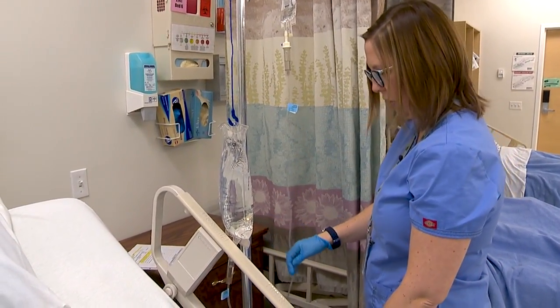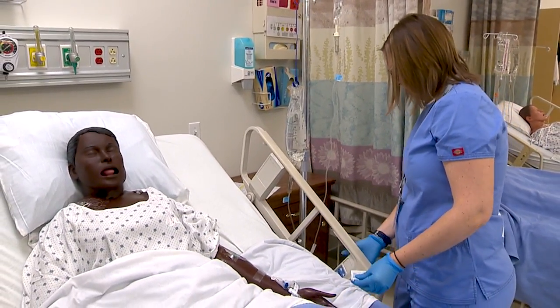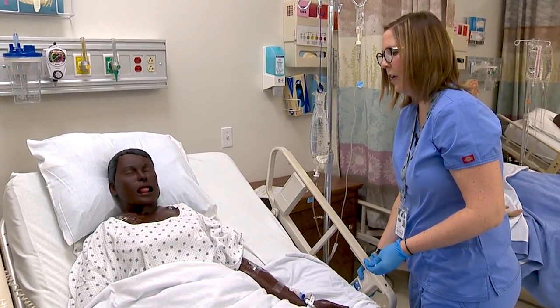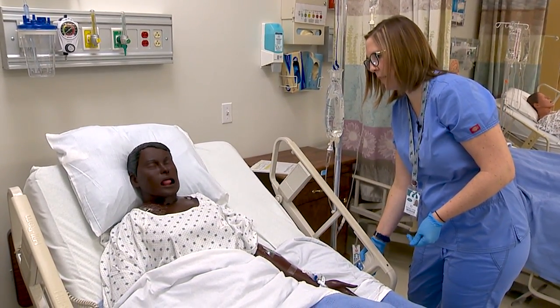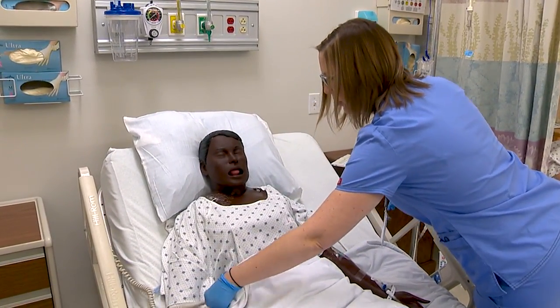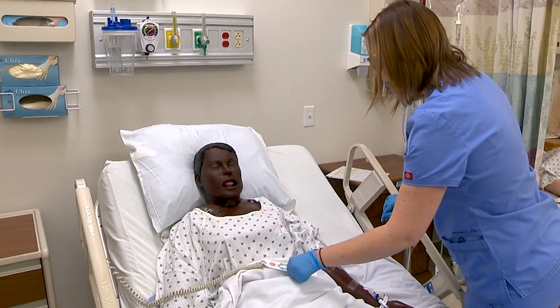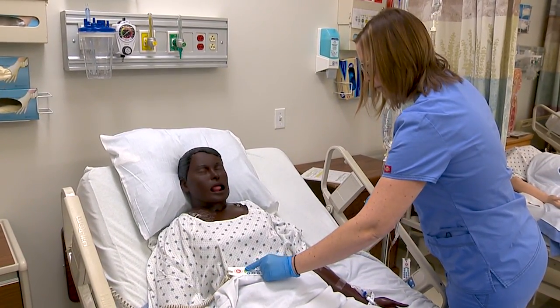All right, Morgan, you're all set here. Is there anything I can get you? I'm fine, thank you. Are you comfortable? Yes. Great. I'll be back in about 15 to 30 minutes to check and make sure that that medication is infusing properly. Here's your call light. Feel free to call us if you have any pain or if you need anything. And let us know if you feel any burning at the IV site. Okay.